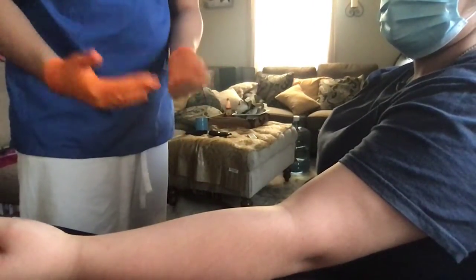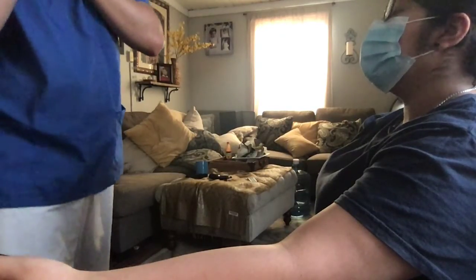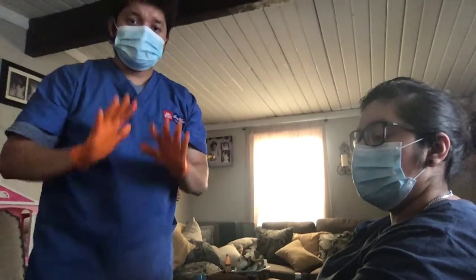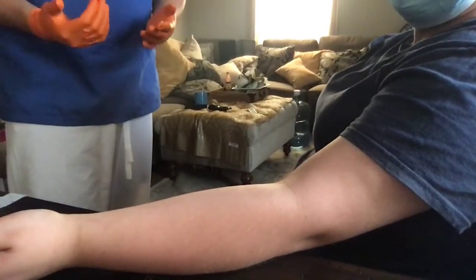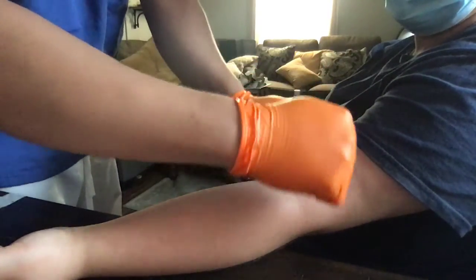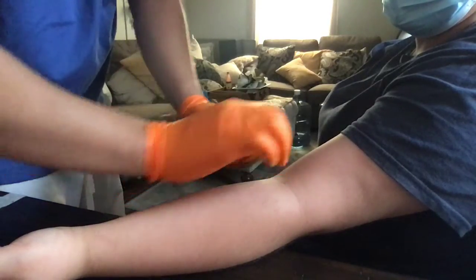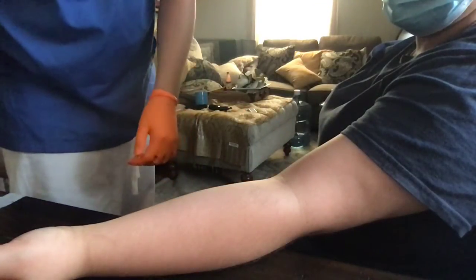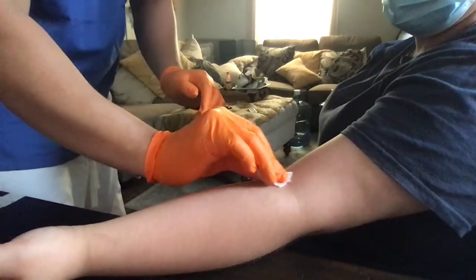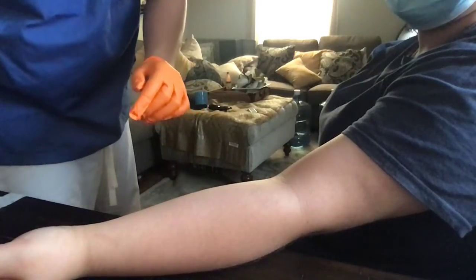I'm going to go ahead and verify the patient first. Can you please verify your name and date of birth? At this point I've already washed my hands. I'm now gloved up and going to begin. I look at the vein and puncture site, tie the tourniquet four inches above the arm, and palpate to look for the vein. I find it. I take it off, get an alcohol wipe, wipe the area to remove bacteria, and let it air dry.